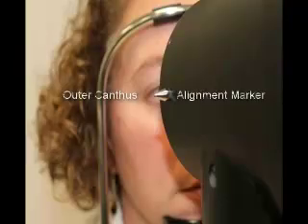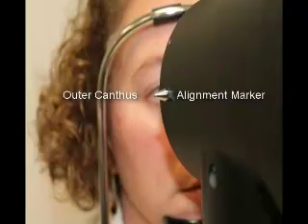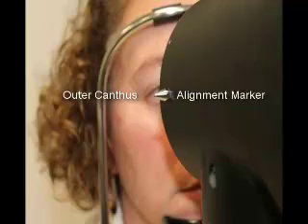Once the patient is positioned comfortably, we are going to align the keratometer to the patient's right outer canthus. Move the elevation knob up or down so the alignment marker is aligned with the outer canthus. Once this is done, occlude the left eye.